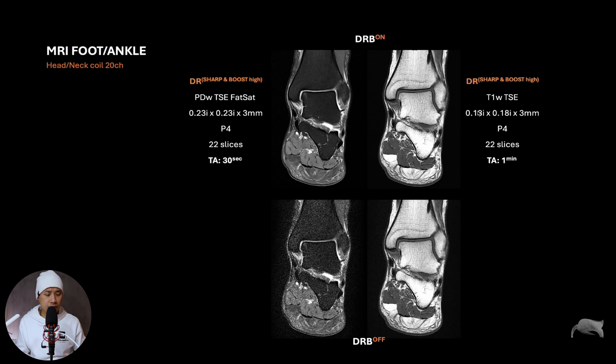This is the T1-weighted sequence. The resolution is 0.18mm interpolated, same coverage, and it takes one minute. You can see there's some noise here. In these settings, if I redid this I would push the sequence even more. As long as you see a lot of noise and then the DRB removes it, you know you're at the peak point. If you turn the DRB off and there's much more noise, that means you can push it further — that's how you know the limit.